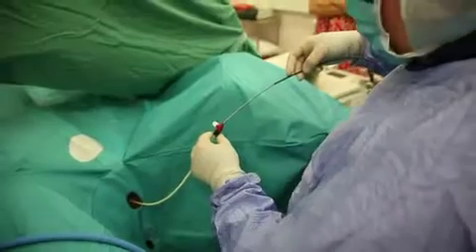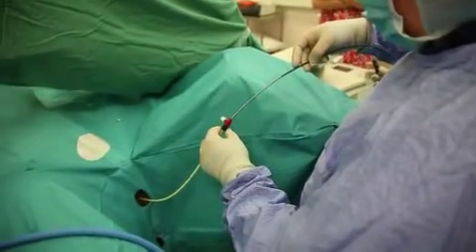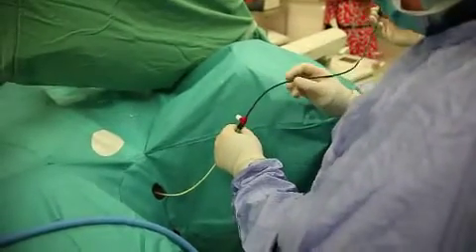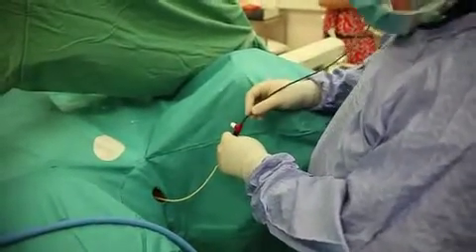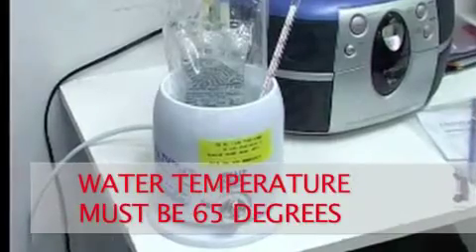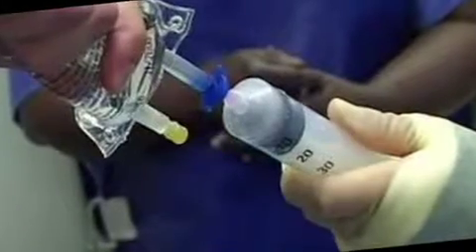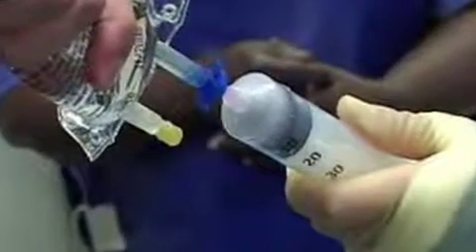Now we are about to insert the Memokath dual cone through the sheath, and this is being delivered. As you can see here, the Memokath stent is in place, and it is above the proximal needle. It is very important that the actual stent is positioned above the level of the stricture. We need to have the warm water ready. This has to be measured with a thermometer. We have the hot water drawn into our syringe.